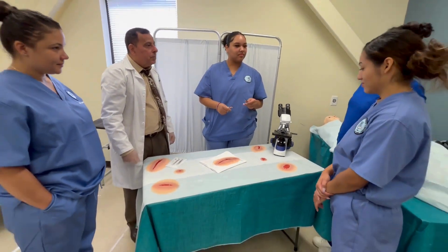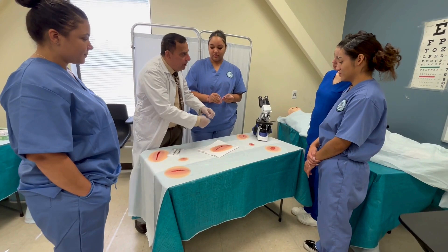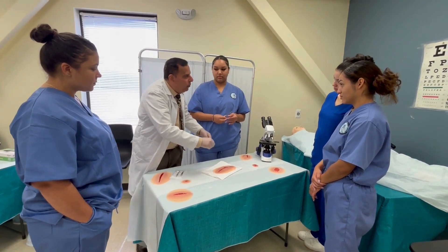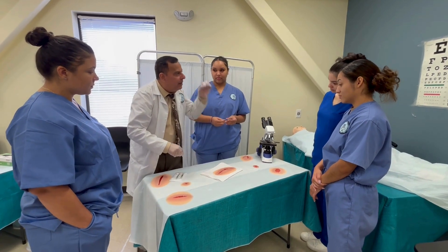There are two types of stitches. One is continuous — for that type you just cut along. The other is interrupted, where each stitch is individual, so every time you cut one, it comes out by itself.